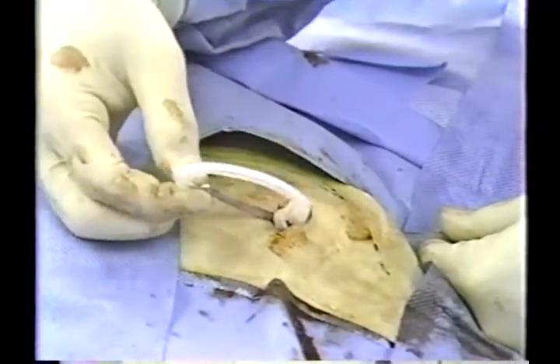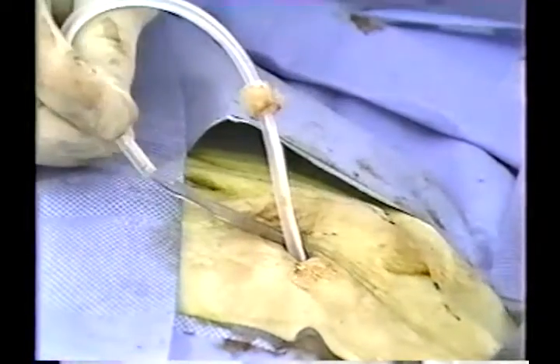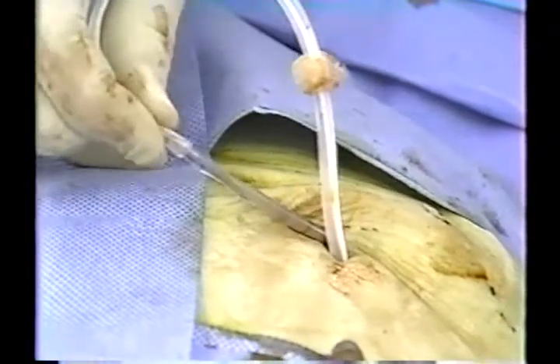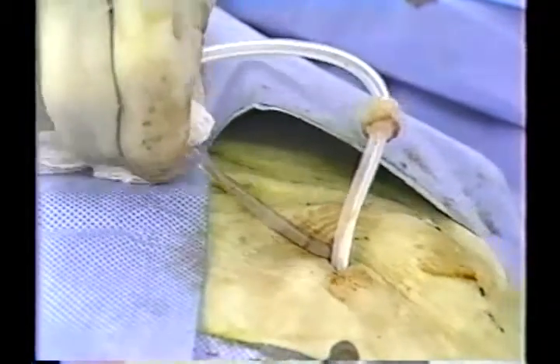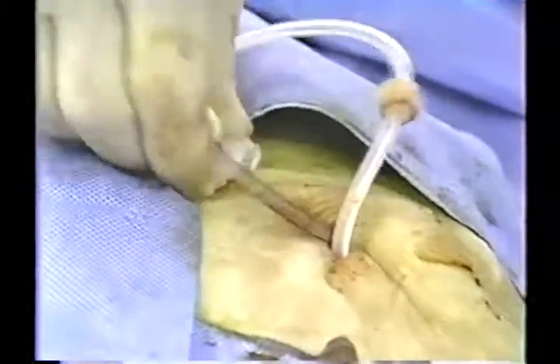The end of the catheter is placed over the tunneler nipple end, which secures the catheter for tunnel entry. It does not have to be tied. The patient does not feel any pain during the tunneling procedure.